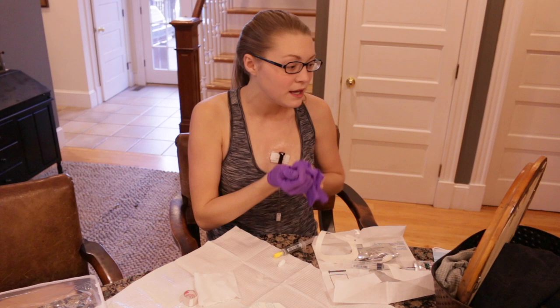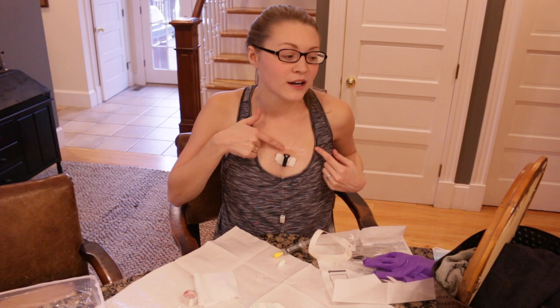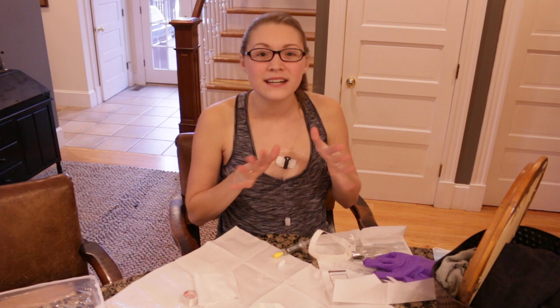I'll say — for the first time in many, many years — that went as well as it could have. I'm glad I got it on the first try. As you can see there's a little air under here and it's stretching a bit. After about an hour, the Tegaderm or whatever dressing you use relaxes a little bit and it won't be so stretchy and red. The air that's under there will seep out after time and the dressing should lay a little bit flatter.